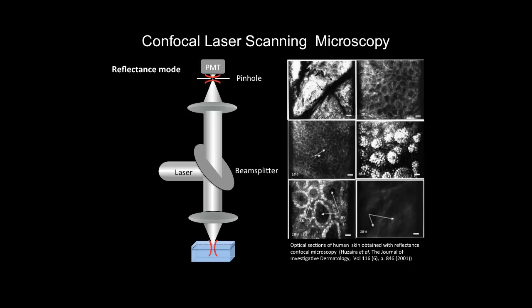It's still quite a superficial technique, right? It images shallow. The fluorophores help, you can get deeper with the fluorescence, but with the reflectance you can't go that deep, especially in scattering tissues like skin. So you're not source power limited in any way? No, we should be fine.